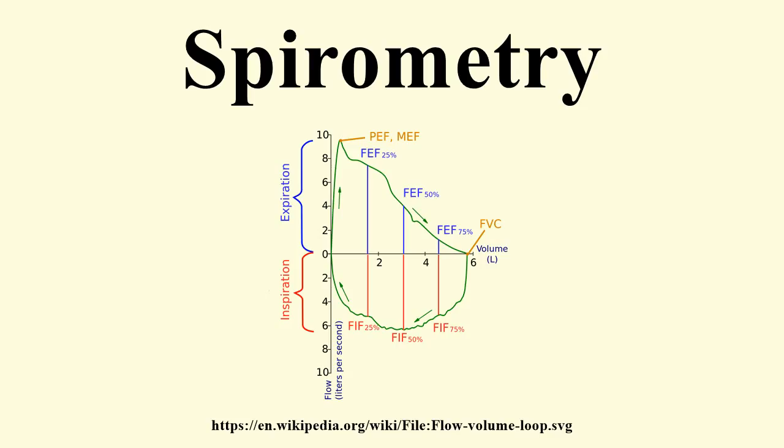It is considered normal if it is 60% to 140% of the average value in the population for any person of similar age, sex and body composition. A derived parameter is the coefficient of retraction, which is Pmax over TLC. Mean transit time. Mean transit time is the area under the flow volume curve divided by the forced vital capacity.